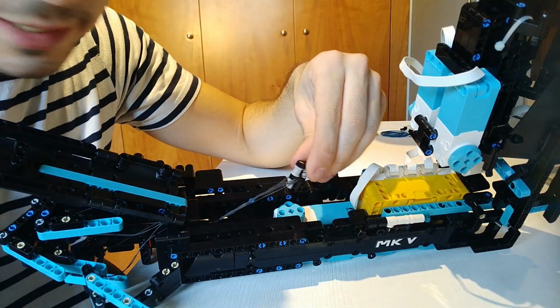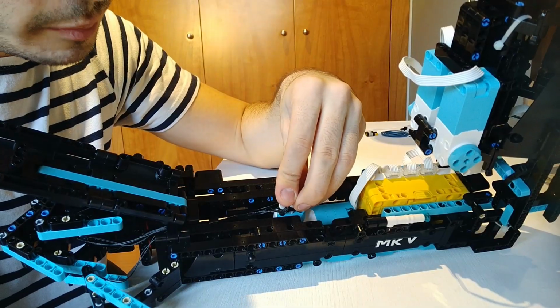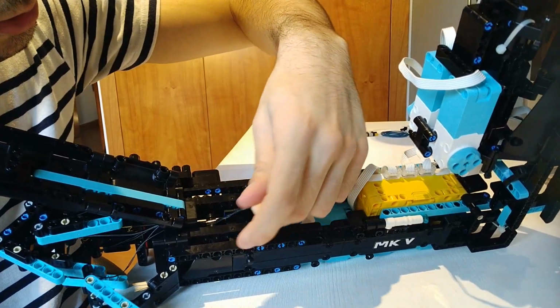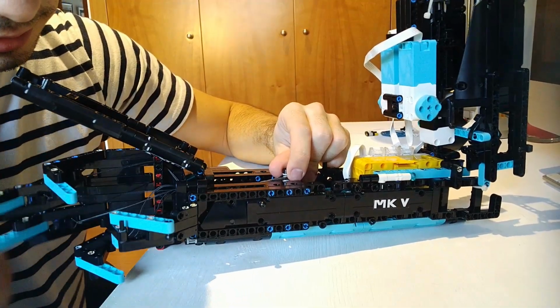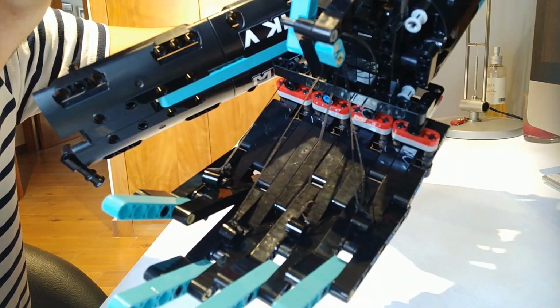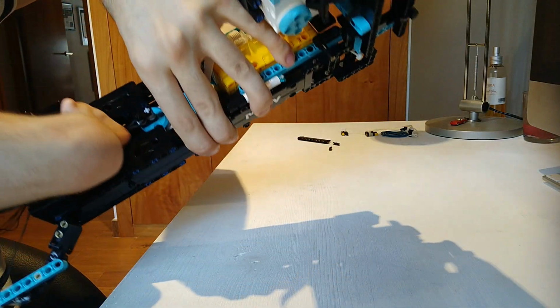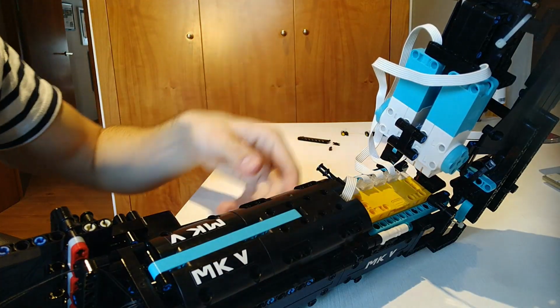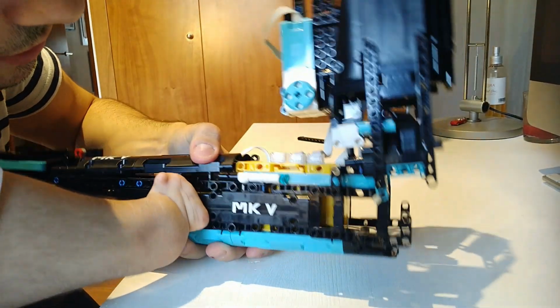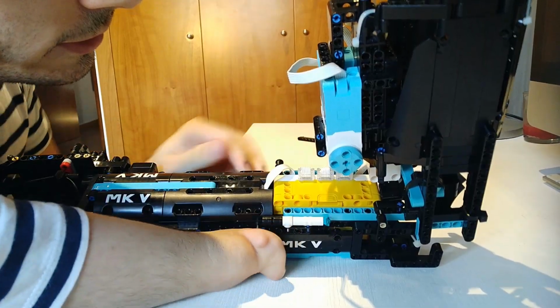So once you've built this, you need to connect the axle in the center of the motor and the pin on one edge. So this is what is going to give control to the hand, to each finger once you connect it. As you can see, when I pull this around, the fingers close. Once you've done connecting every single finger, including this one, to a cable, and then the cables going inside this little hole and then on the motor, you can actually close this part right here. And you can see there's a little space right here, so the cable can go through it without a problem. And the only part that you need to fix right now is this.